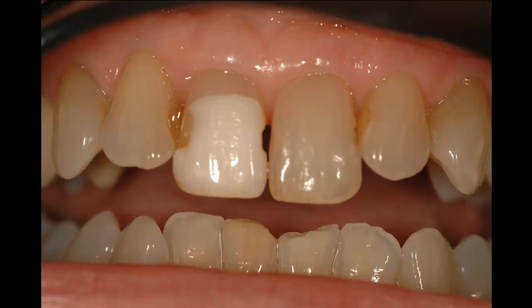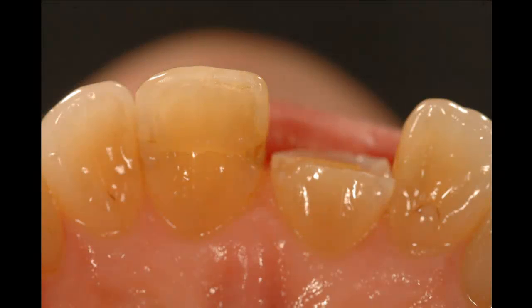As we were looking a little closer at the case, we realized that the other central had some issues as well. As you can see on the inside here, the other central is cracked about the same height as the first one that broke, plus with some mesial decay. This is likely going to end up the same as the first central. So we recommended that we do both of them together and copy the shape and form as close as possible to what she already had, so it wouldn't be a big change.